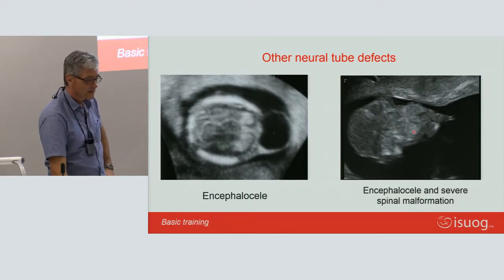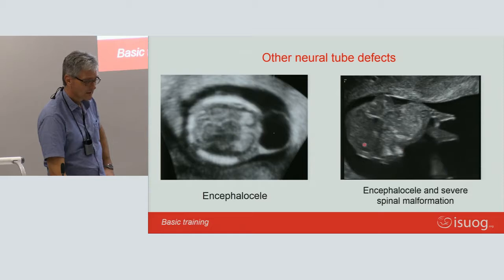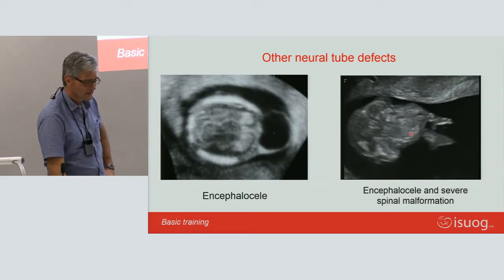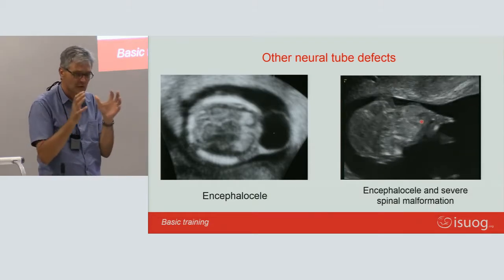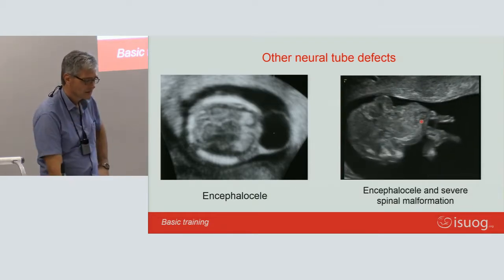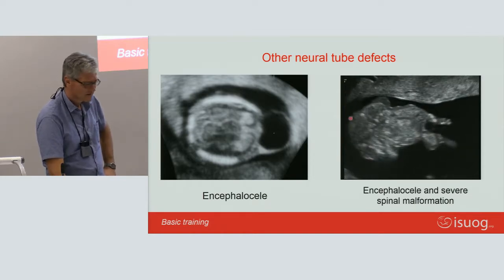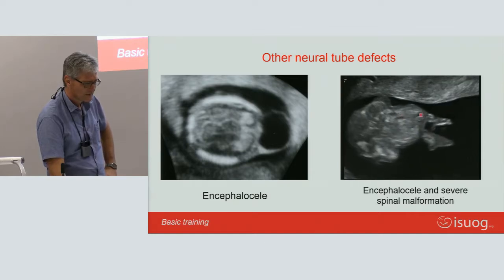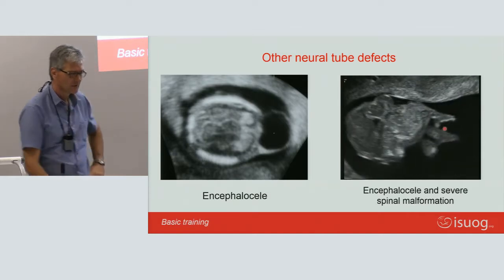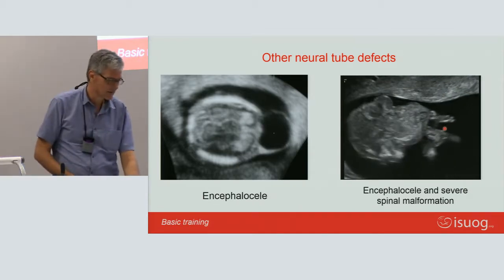And this is a baby, you can see 2 legs and a bladder, but you can just see everything's really horribly wrong. It's a very foreshortened baby, so there is an encephalocele. I also don't really see very nice cranial vaults, but probably enough to keep the brain intact. And the severe spinal malformations, a very foreshortened spine, maybe something like an iniencephaly.